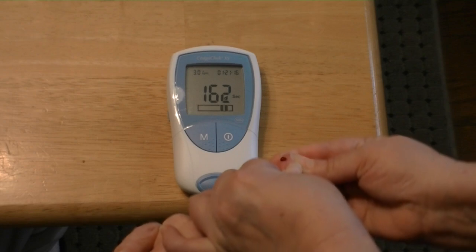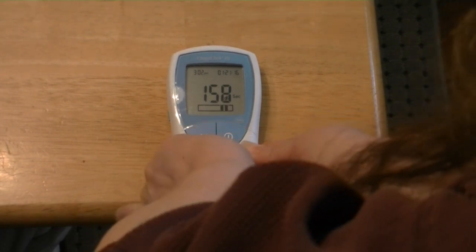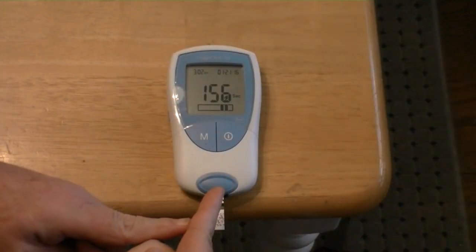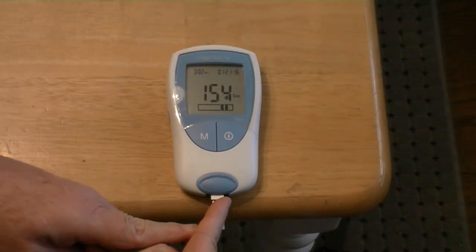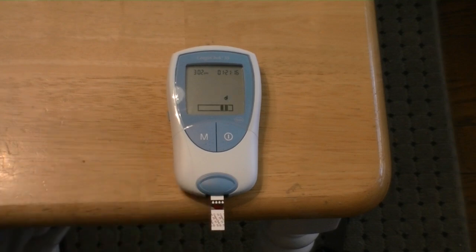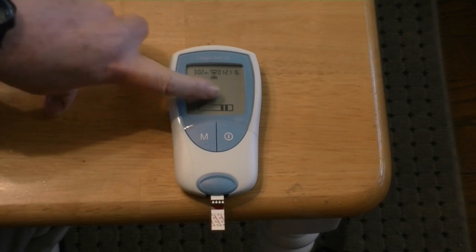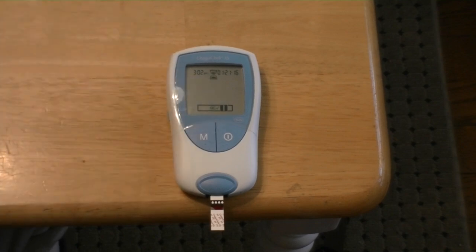It looks like today is going to be a good one. Then we turn it upside down, use another finger to guide it in, make the deposit, and then it should beep at you — which it did. And then it's going to give you a checkmark that says QC. That means it's accepted the blood, it was a good sample, and it's now drawing the blood up into the machine.